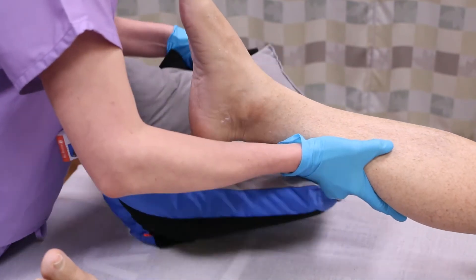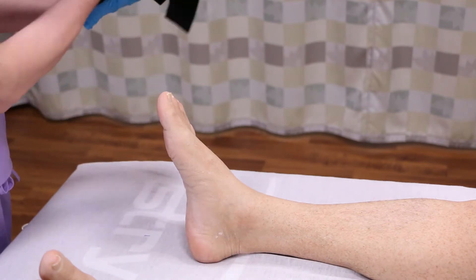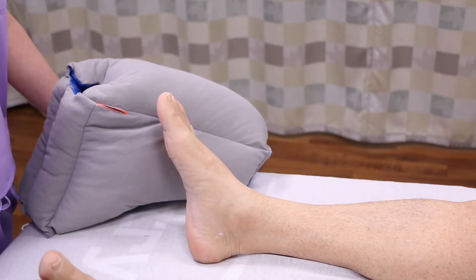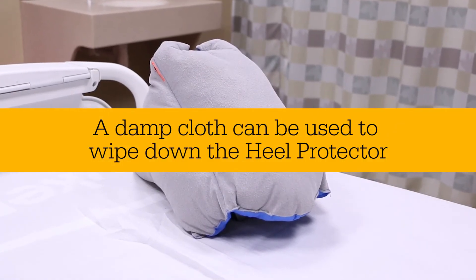To remove, simply detach the closure straps, remove the heel protector, and turn it inside out. This makes it easier to position the heel when putting it back on. If needed, a damp cloth can be used to wipe down the heel protector.